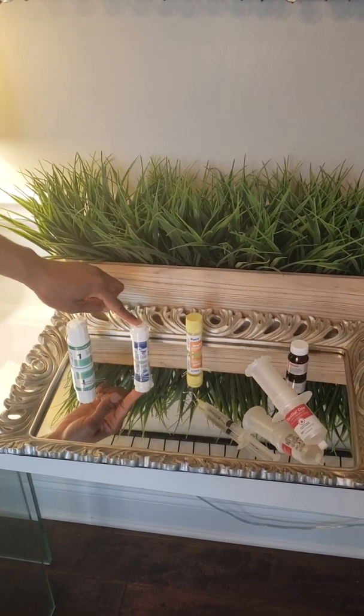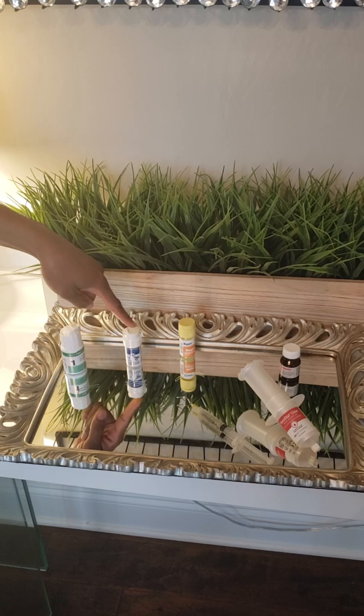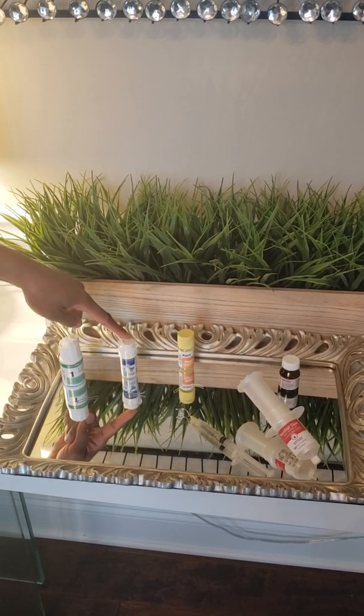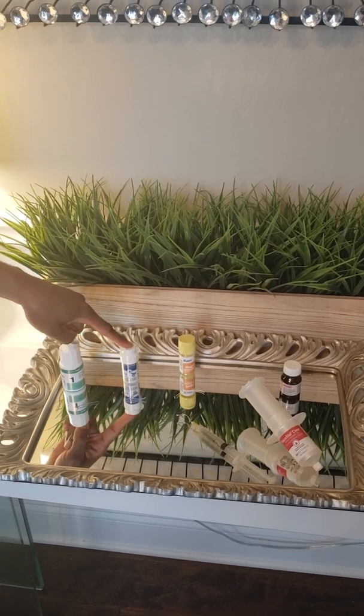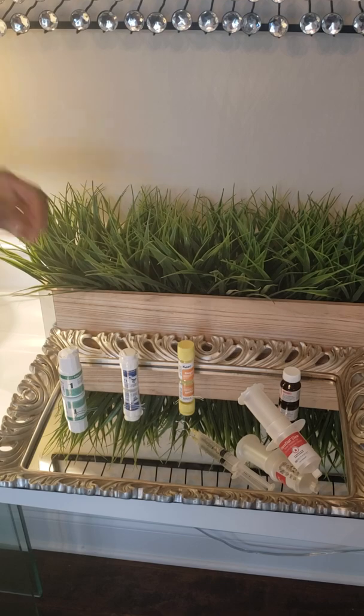The next cord that's very popular as well is a really good cord. It's also the size number 1. Now this is not impregnated with any epinephrine to stop the bleeding, so I would definitely make sure that I dip this particular cord in this agent that does stop the bleeding to make sure that everything looks nice and clean.